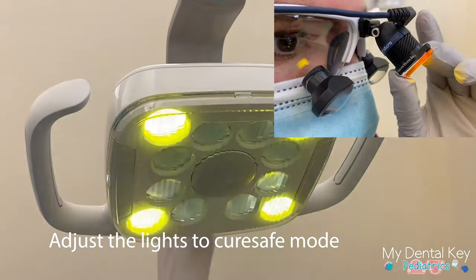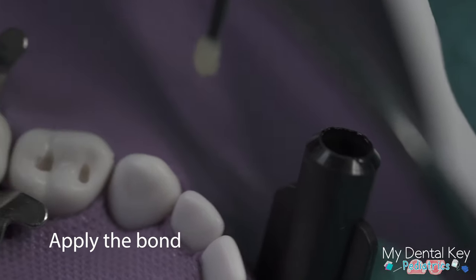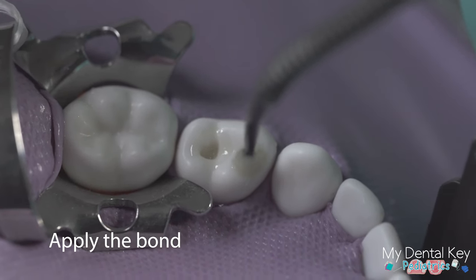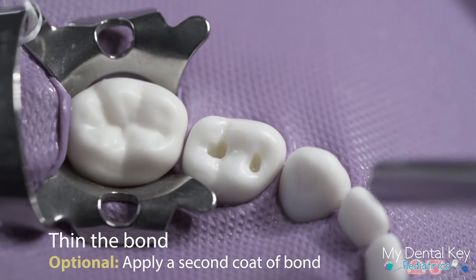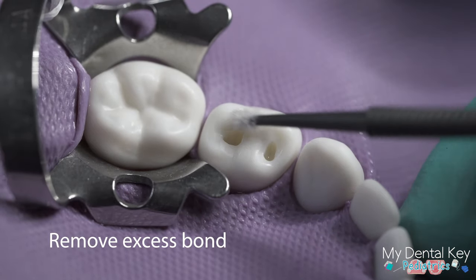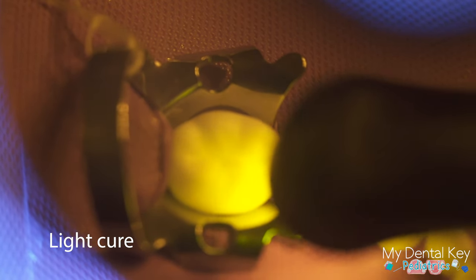Turn the overhead light and your loop light to cure safe mode. Apply the bonding agent for 15 seconds according to the manufacturer's instructions, being sure to apply it to all surfaces you wish to apply composite to. Apply a light stream of air to thin the bonding agent, then use a clean micro brush to remove any excess bond that is not on the prepared surface. Light cure the bonding agent according to the manufacturer's instructions for your light.